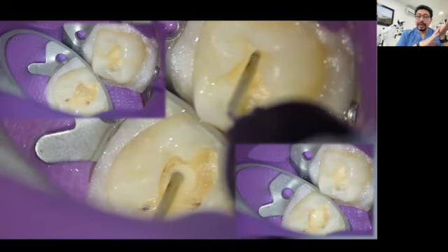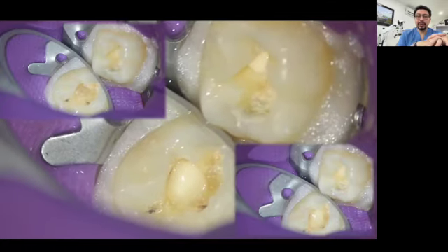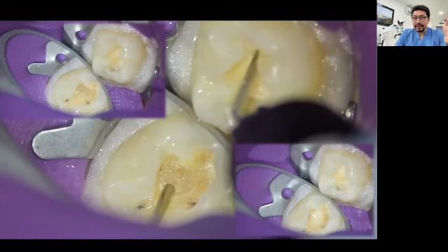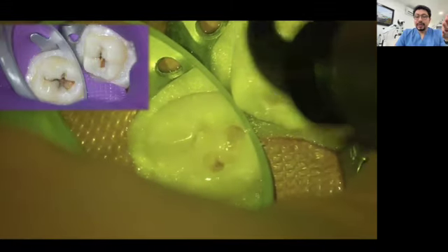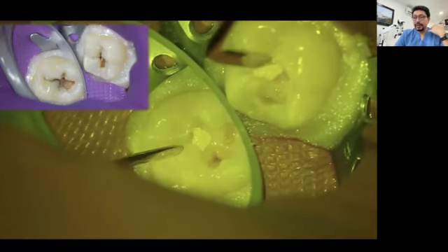And we can decide, okay, do I need to place a base? I am going to use a glass ionomer, maybe a bioactive material, and then we can proceed with our coronal restoration, with the adhesive restoration.